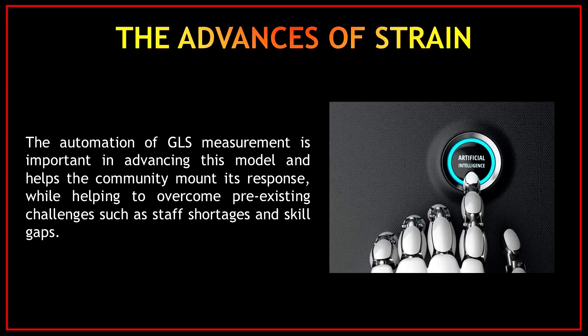The automation of global longitudinal strain measurements is important in advancing this model and helps the community mount its response, while helping to overcome pre-existing challenges such as staff shortages and skill gaps.